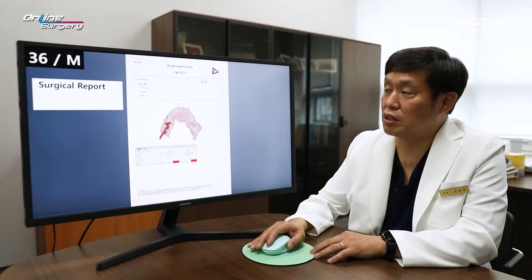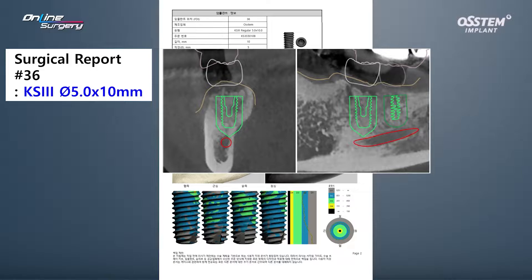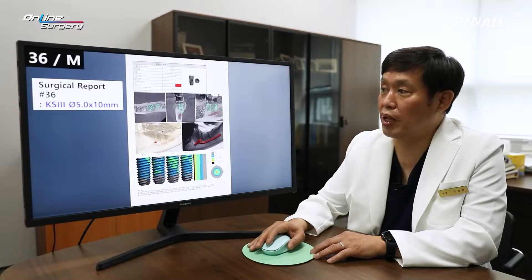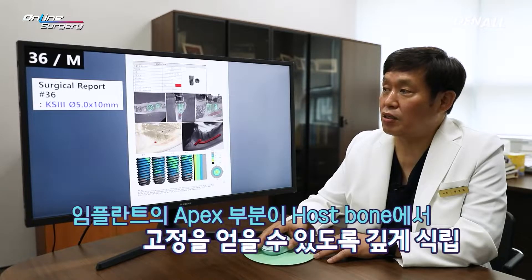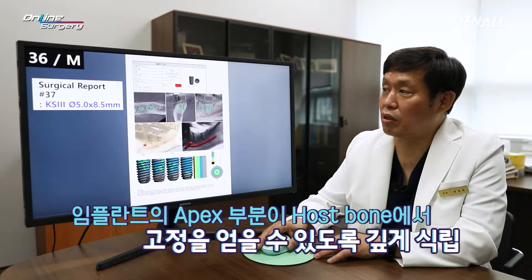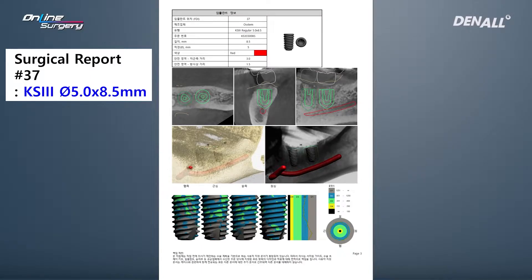One guide was to be used to place the implants. For number 36, a KS3 5.0 x 10 mm implant was planned. I decided to place the implant closer to the nerve because after removing the earlier implant and doing GBR, I wanted the implant to be in contact with the host bone — especially in the apex area — to get better primary stability, so I planned to place it deeper. For number 37, a KS3 5.0 x 8.5 implant was planned, also placed deeper so the apex side would contact the host bone.